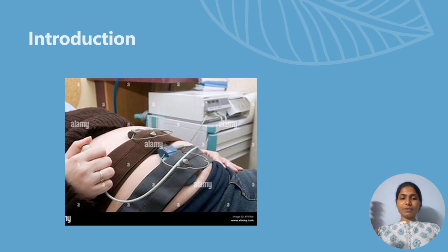She presses or clicks it when she perceives fetal movement. This is also depicted in the graph. Whenever fetal movement is depicted, if there is an increase in heart rate, that means there is acceleration during fetal movement. The strip moves in the machine at the speed of 1 centimeter per minute, which is considered standard.